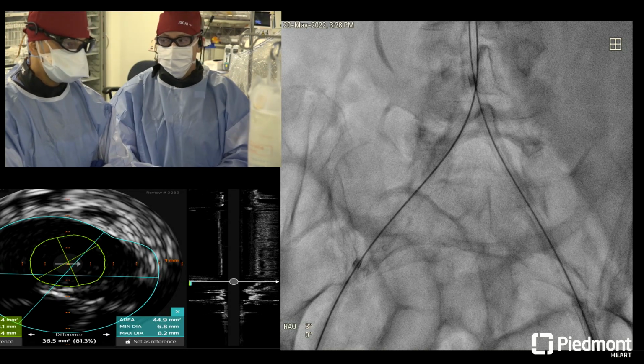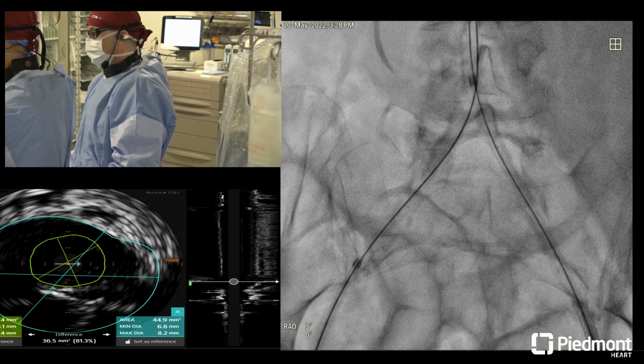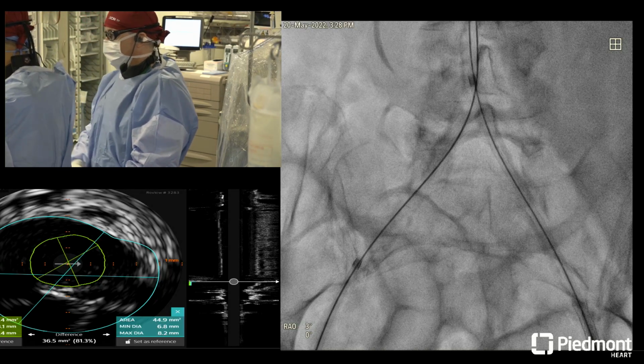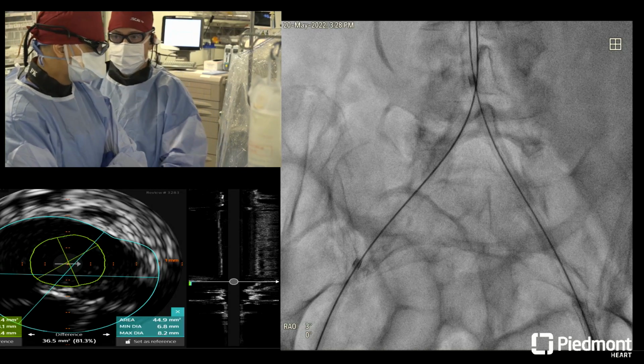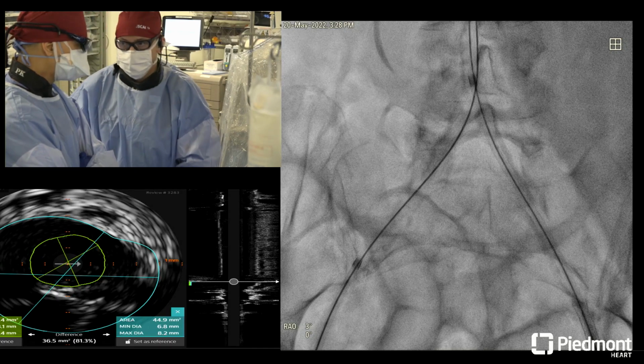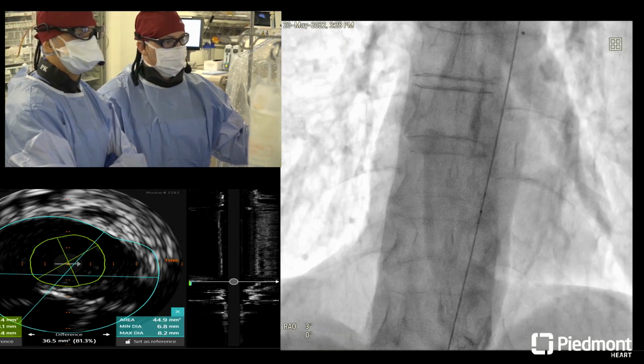The rest of the way, it's probably just standard bare metals, and then you're self-expanding in the external. Yeah. And then how about that? So I just want to make sure we're clear on what we're doing in that distal aorta. Are we extending the pipe all the way up? Are we placing a single covered there to seal that up? And then what do we think about those lumbar collaterals down?